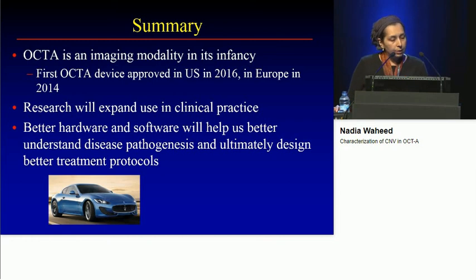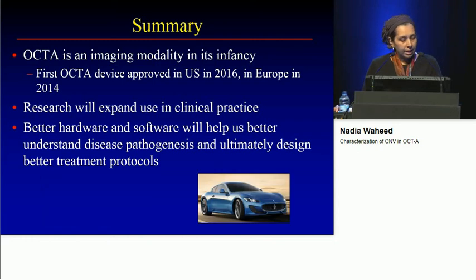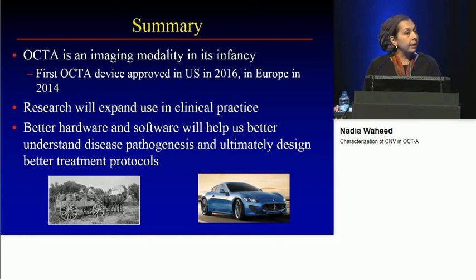So still an imaging modality in its infancy, but I think we're right at the point where we've stopped looking at this as a shiny new car and are starting to see that it really does represent to a large extent a paradigm change in the way that we're looking at our patients with CNV and following them up over time.